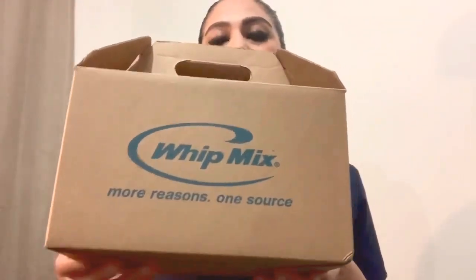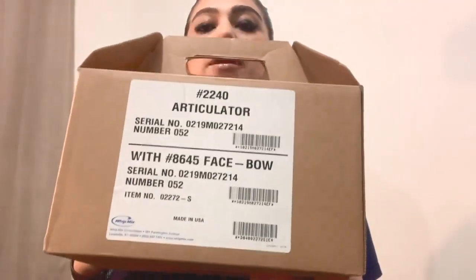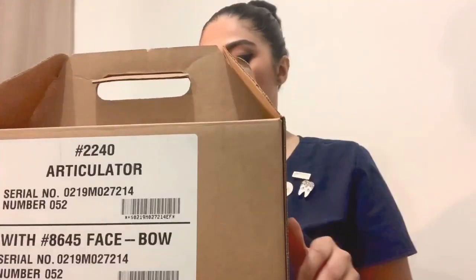As you can see, this is the box of the Whip Mix. You can see here the serial number and the item number of the Whip Mix. Let's open the box.